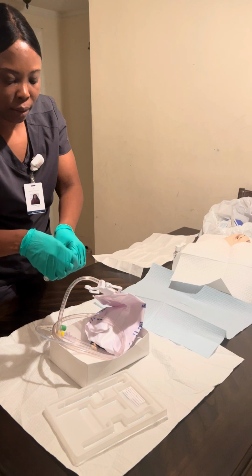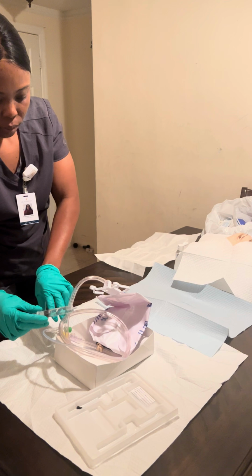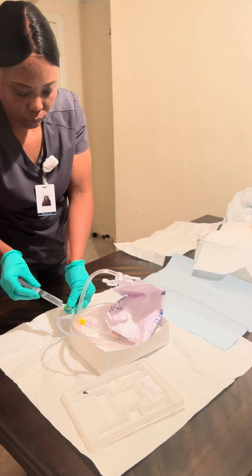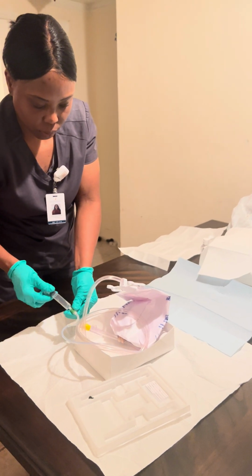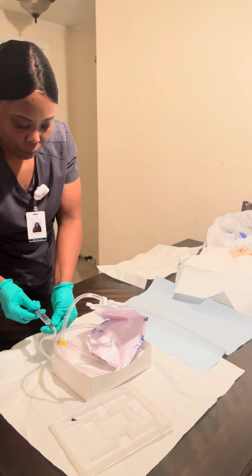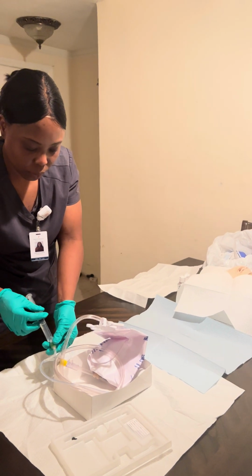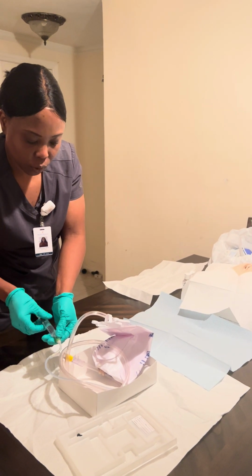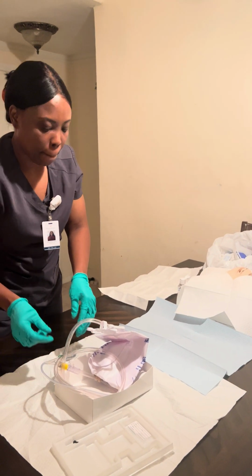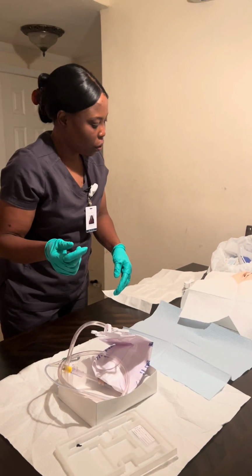Now I'm gonna attach the syringe. I'm gonna make sure it's 10 cc of fluid, 2 to 3 inches. And then, Mrs. Smith, I'm gonna insert the catheter now.